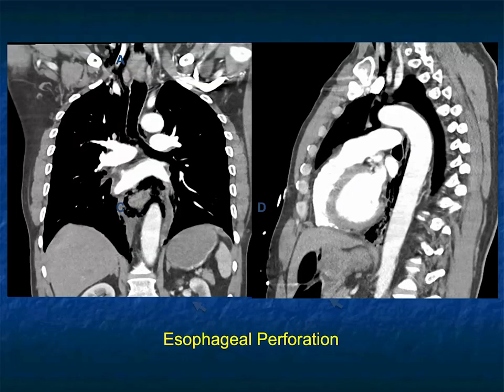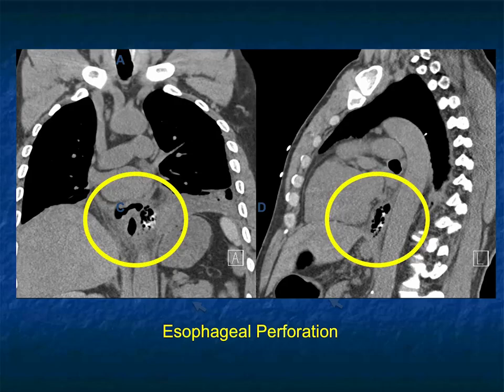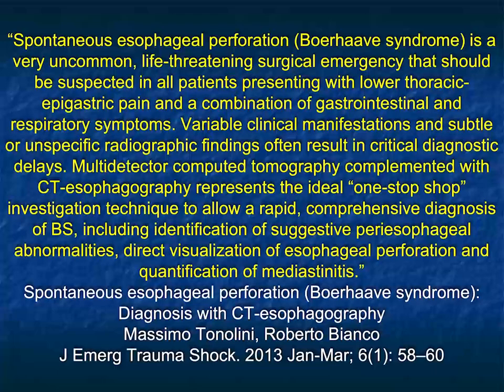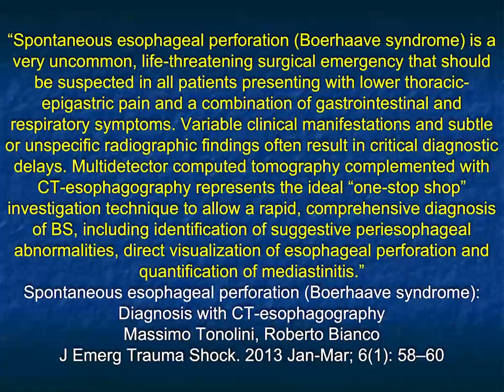When you see the air, you know there's a perforation. There are other reasons for air in the mediastinum — tracheal injuries, barotrauma, for example — but when you're thinking about the esophagus, seeing the air gives you the diagnosis, though the location can be more challenging. The initial study showed the air, but we couldn't exactly connect it to the esophagus; after the swallow, you see the positive contrast. People in the past would get esophagrams or swallow studies, but these days most people don't know how to do swallows, and in the ER setting everybody has a scanner and you can quickly make the diagnosis.